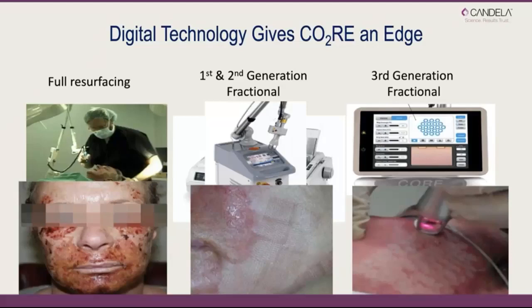And of course, there's more pain involved. We either need to give nerve blocks or sedation, or frequently both of them together. It's a very intense process for the patient. And because we're breaking the skin, there is more risk of infection, scarring, other complications. So it was a very good technique.